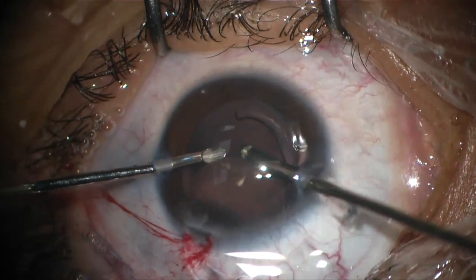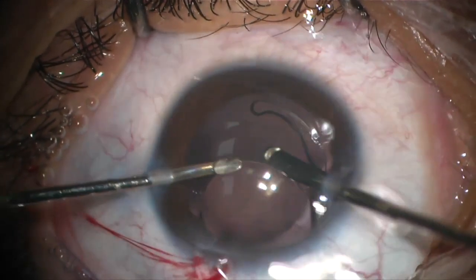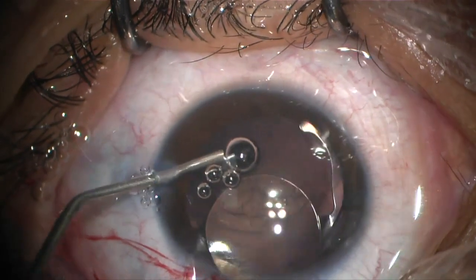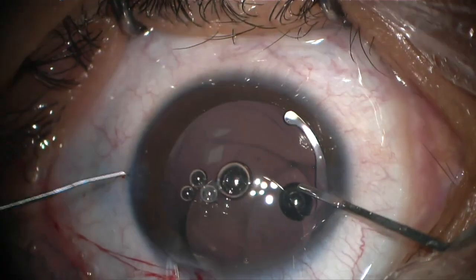After vitrectomy and assessment of the posterior capsule rupture, it is found to be central and not extending to the periphery. It resembles a posterior capsulorhexis but is irregular, so the plan is to place the IOL in the bag.